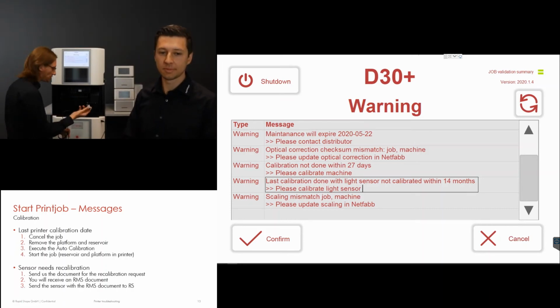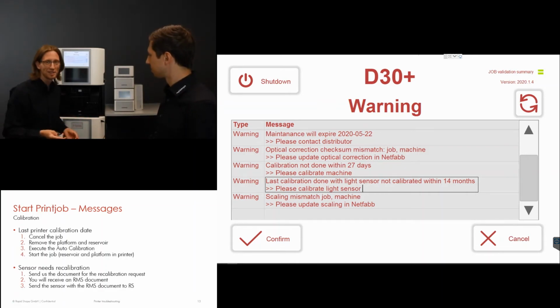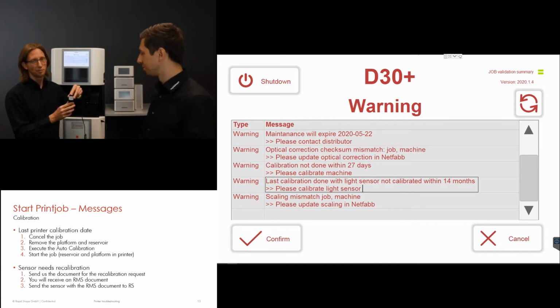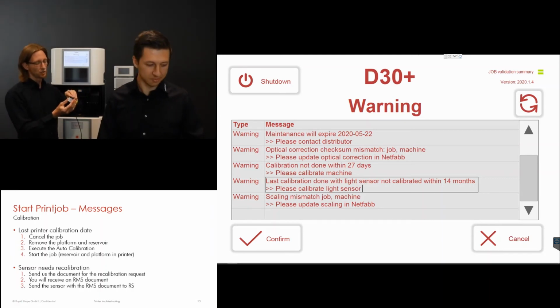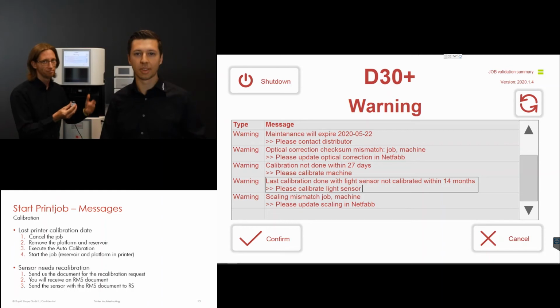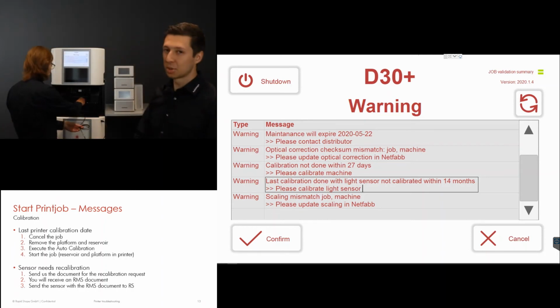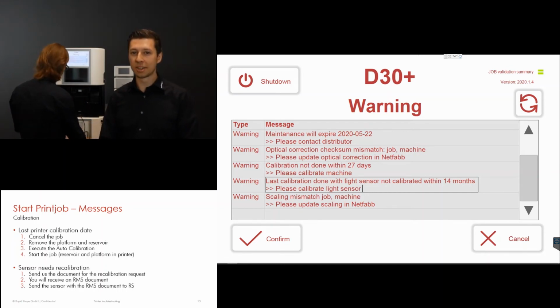As always, this is quite basic knowledge, but maybe one thing that could happen is, you know that we have this glass element right here, and this must face the bottom of the machine. We just had a service case a couple of days ago where it was inserted upside down, and then it's pretty obvious that you cannot measure anything. I think we talked about this in another webinar, because it's just often happening and we're wondering why.